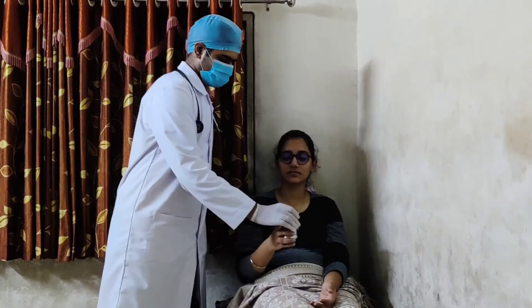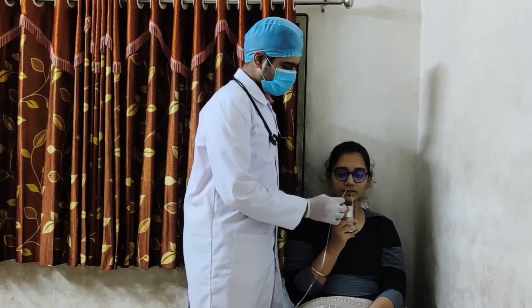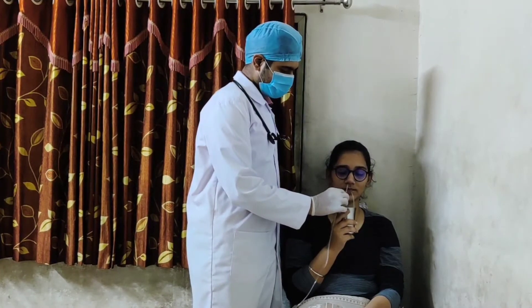First, lubricate the tip of the nasogastric tube with a lubricant. Then give the patient a glass of water with a straw and ask the patient to sip the water during the procedure.